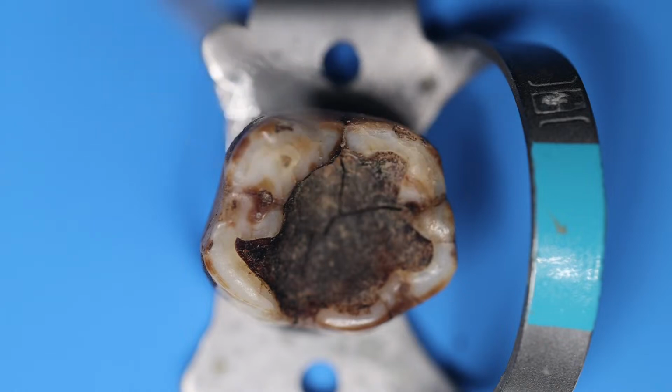So you can see that this is grossly decayed.